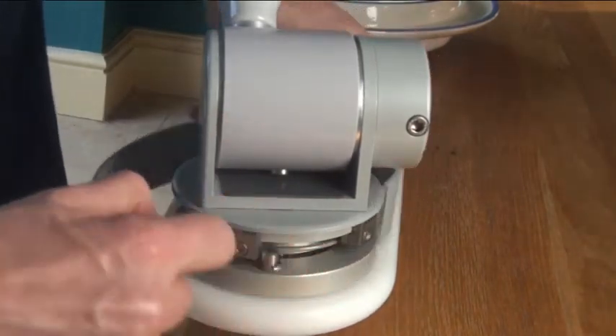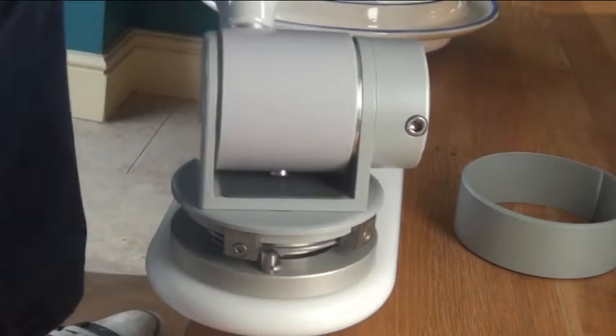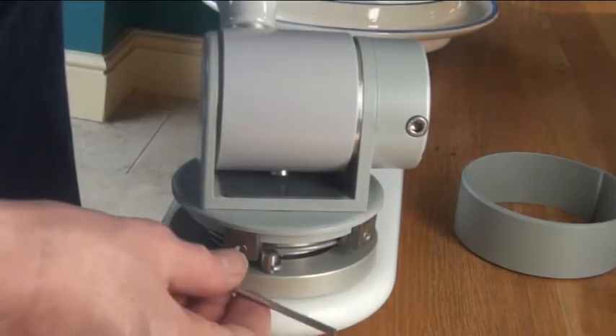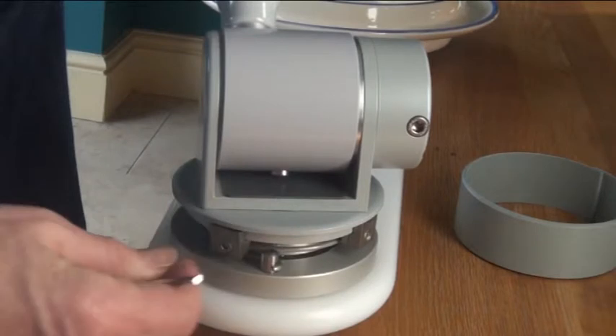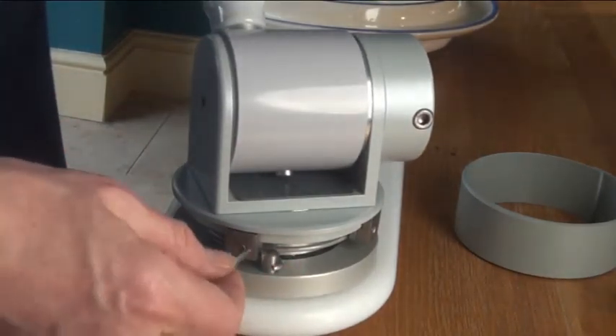Just prise off this cover. This is the forward stop — you can see it pushes against the peg to stop the arm coming too far forward. If I loosen this screw and then readjust the position, push it against the peg and then re-tighten the screw.